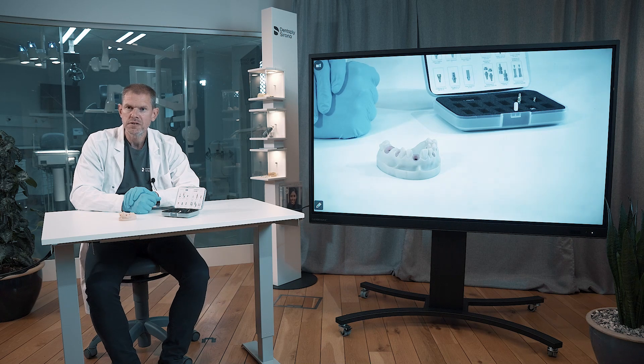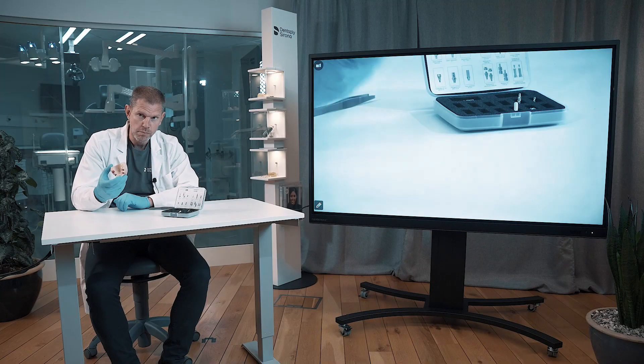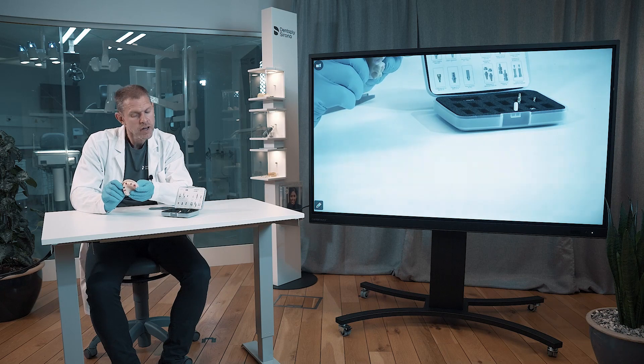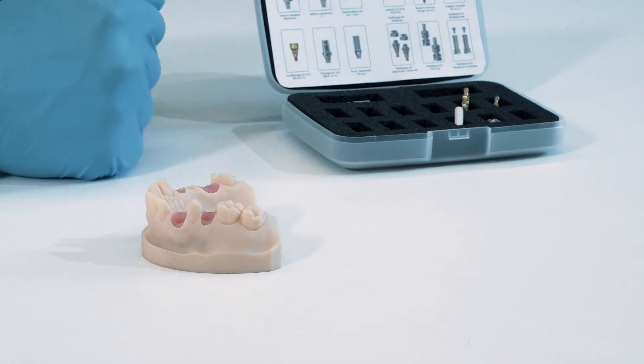Welcome to the restorative hands-on for the prosthetics for the DS implants. What you see here in front of me is the model — the new model for the systems and the restorative parts. We also have this box with a lot of restorative components.